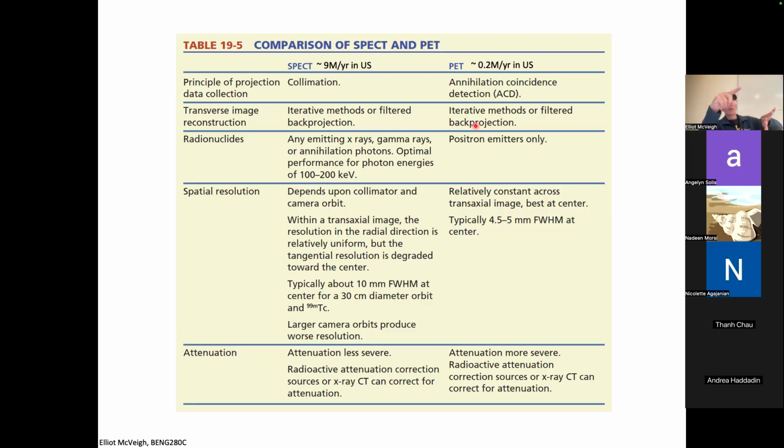So if the raw data is noisy like this, your forward model might project into the raw data space, and you say, well, if this is my object, this is the raw data I would have. When you project in there, you see it goes smoothly through the raw data that has this noise on it, right? And so the image you get is a filtered estimate of what's there, but it's filtered by the probability of being the correct data, right?